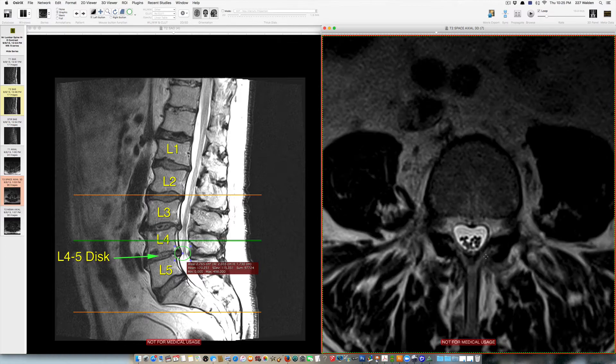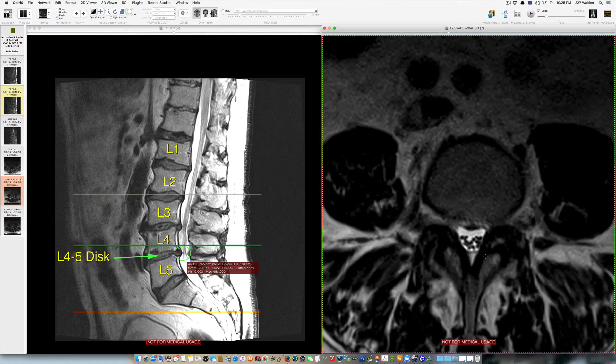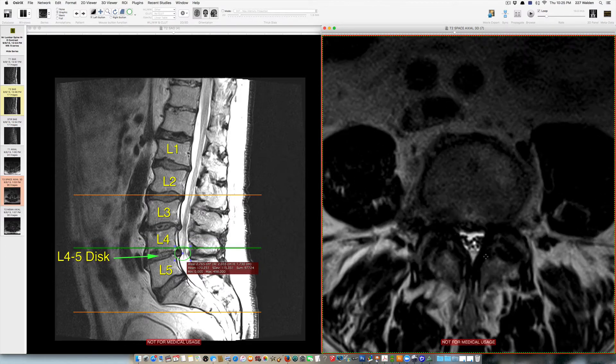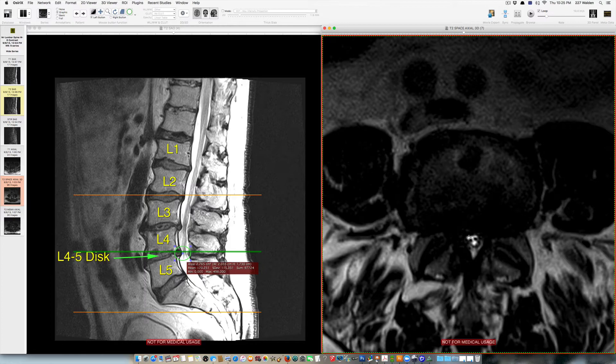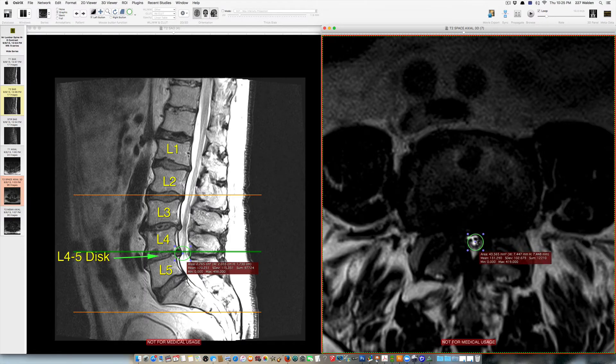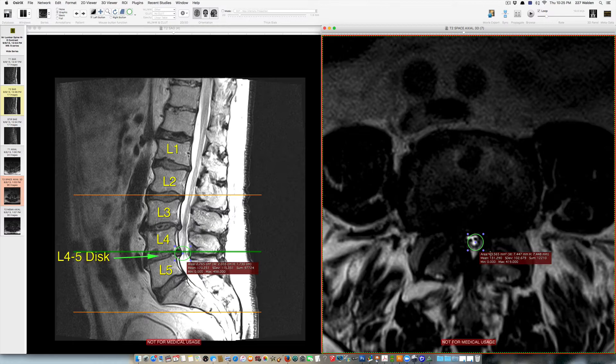And if we keep going down we'll see the same thing again here at the L4-L5 level where again there's very little space available for the spinal cord and the nerve roots with an area that's about a third of the normal size.